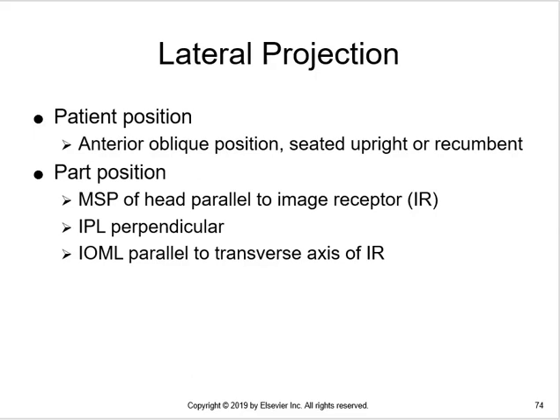So instead of jumping into the projections, what I'm going to do is skip forward. We're going to take a look at some x-rays and some fractures and things that we might shoot skulls for.